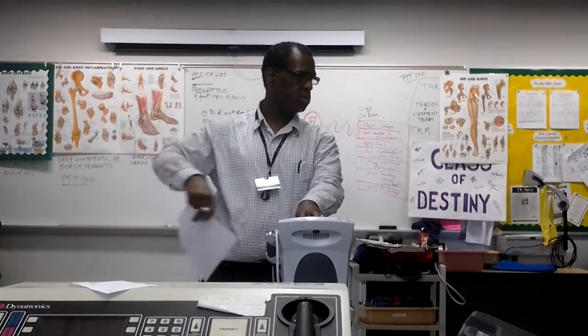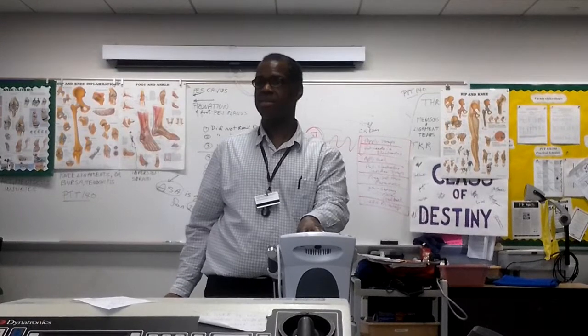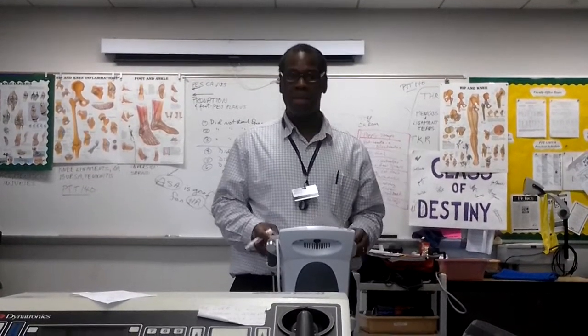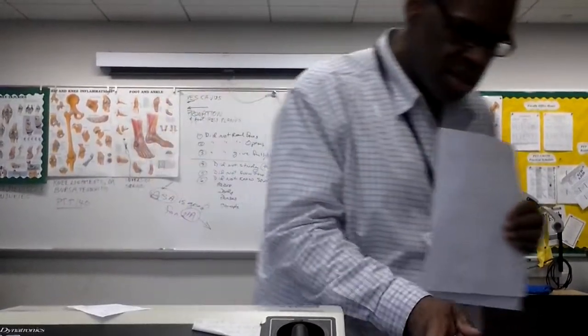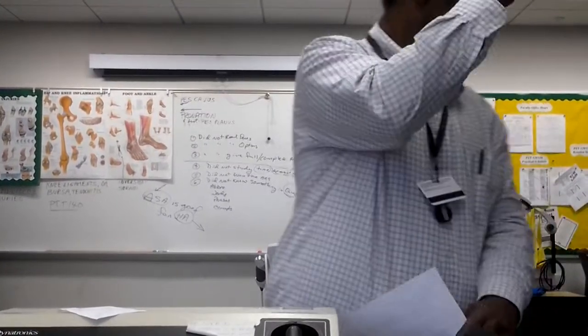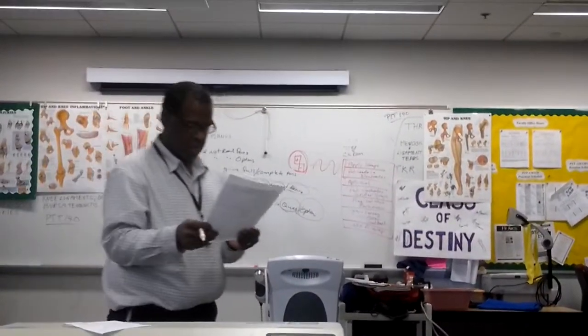Machine is also a bi. So we got bi. Okay, biphasic. So why is it that a tens unit can't work a quad to get extension, but this unit can? Because of the strength. Okay, so, the power. Can this do it? Yes. NMES? Okay, good. All right, let's move on.